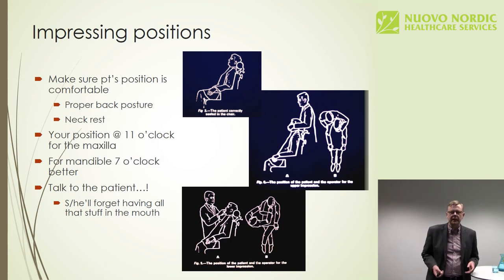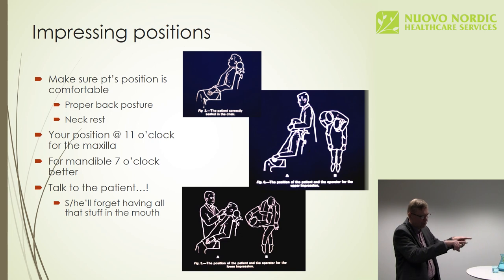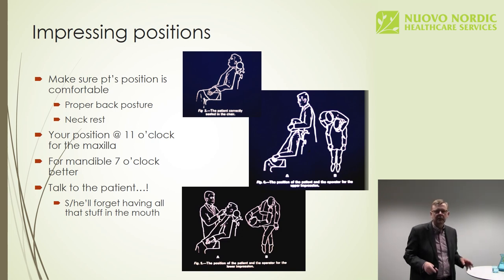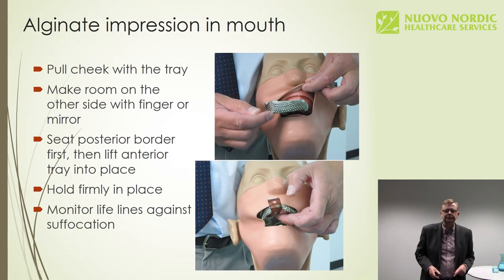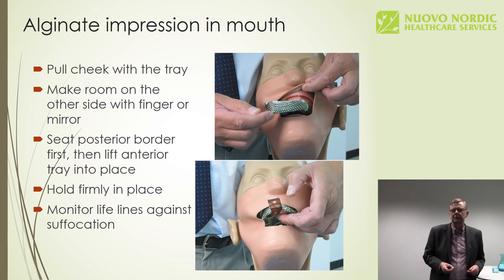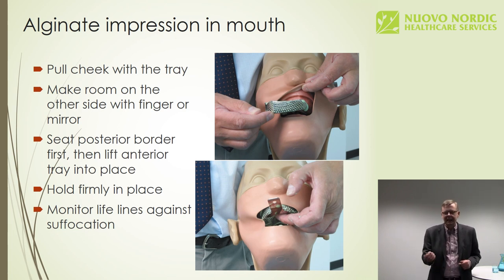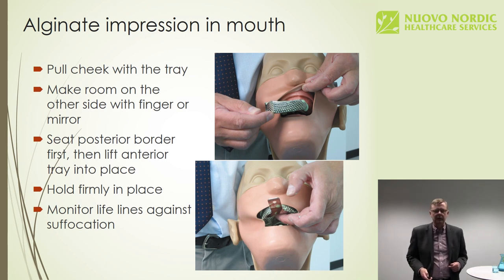For the lower jaw, taking an impression is easier if you stand in front of the patient, and in that way you will be able to monitor the buccal areas and move the cheeks aside. As you can see, when you put the impression tray into the mouth, you can also pull the right corner of the lips with the tray, and in a way turn the tray into the mouth.